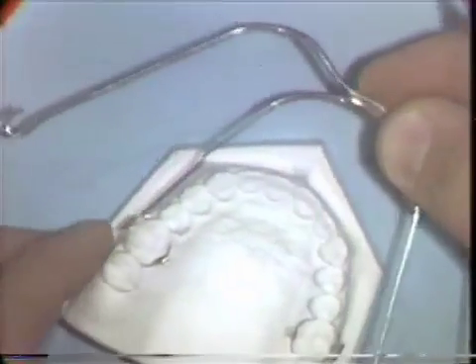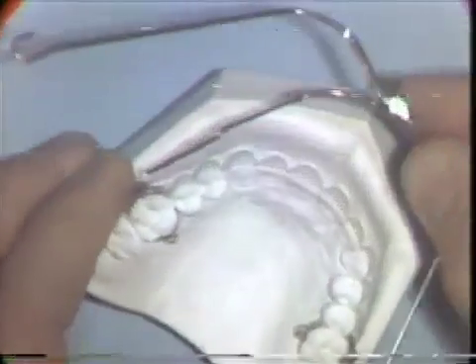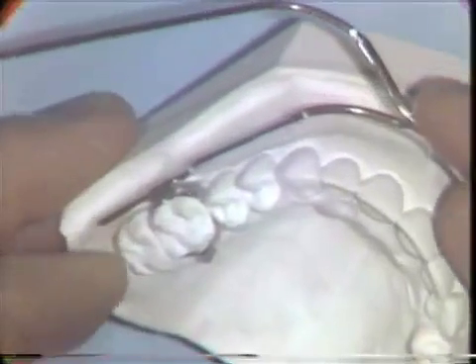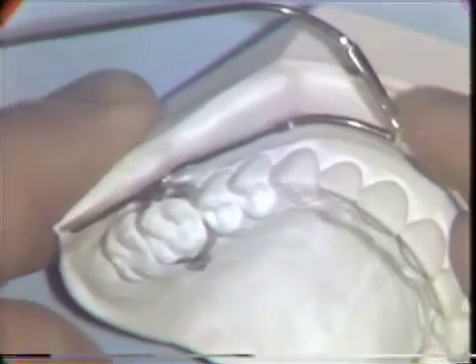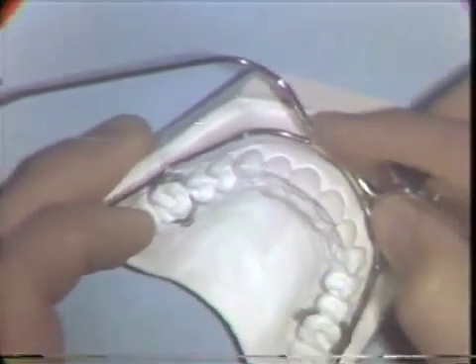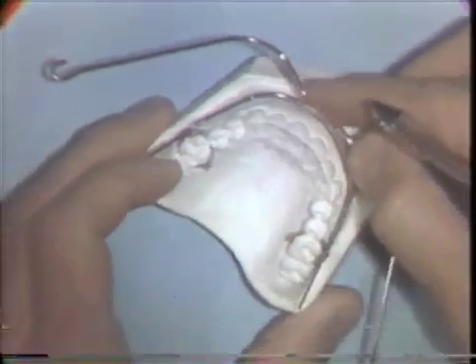The bayonet bend provides a stop to prevent the Facebow from sliding too far into the tube. The bayonet bend stops the Facebow there. The same procedure is used to make the bayonet bend on the opposite side.